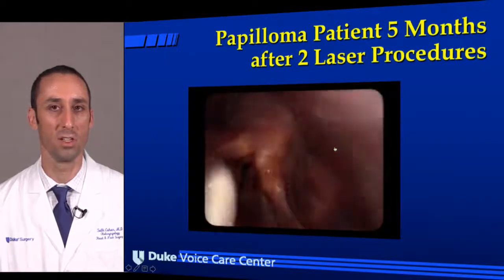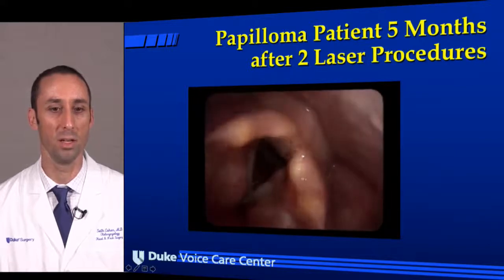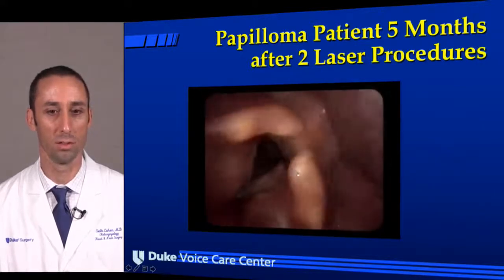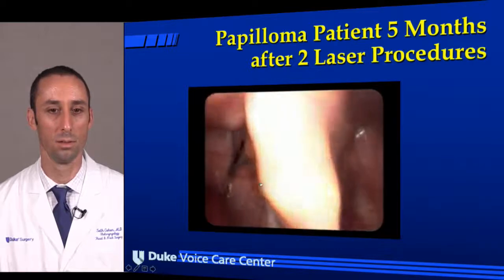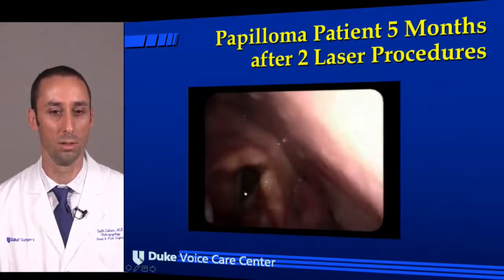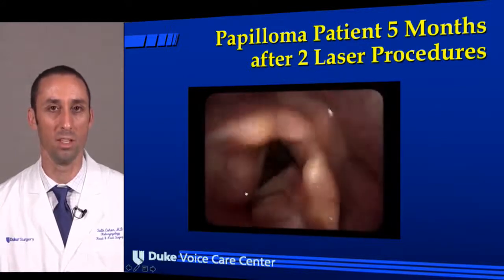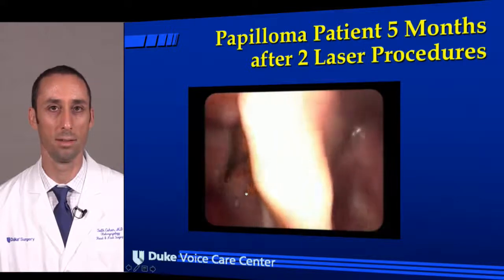So this is a papilloma patient. He's now had 2 procedures and he's 5 months out from that, and you can see a much better edge to his vocal folds compared to what he had before. Better closure, and a much happier patient, and he's been able to avoid the operating room. These patients can drive themselves into clinic.